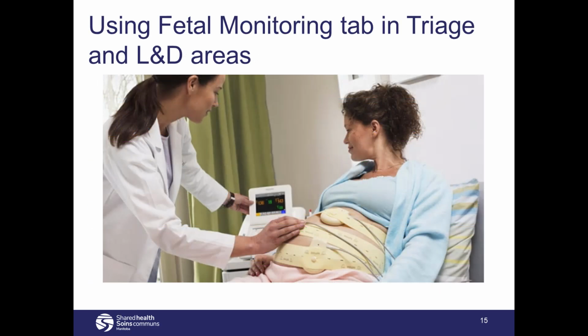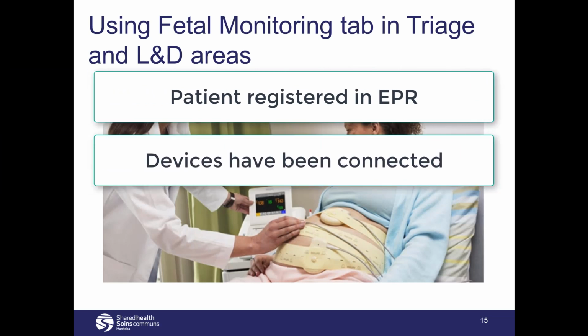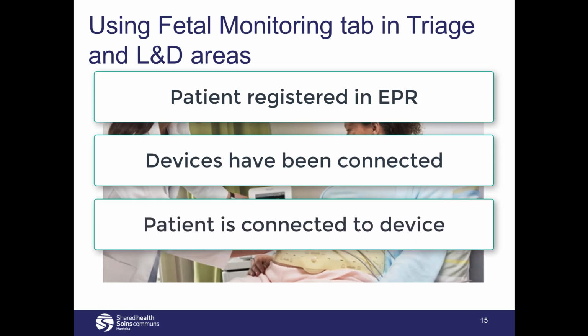Now, let's see how to use the fetal monitoring tab in clinical EPR. For the purpose of this demo, the following activities have already taken place. Our patient has been registered in EPR. The devices in the triage and L&D areas have been connected and do not need to be connected by the user, and the patient is connected to the device.